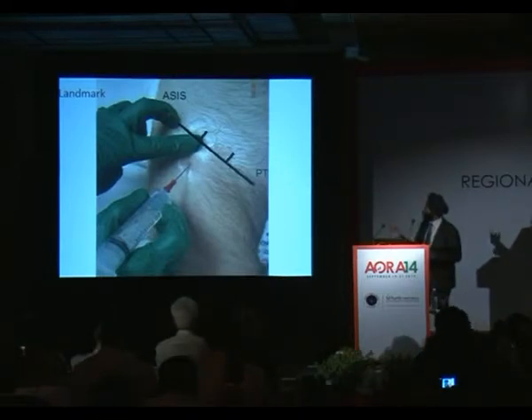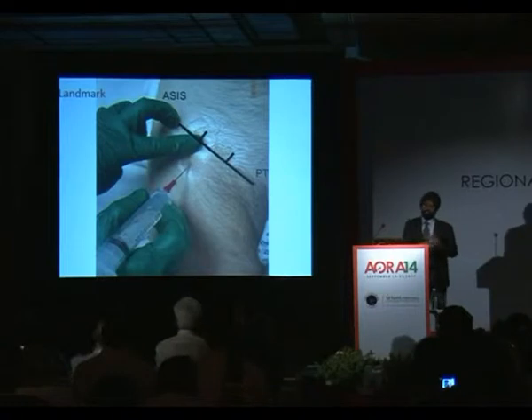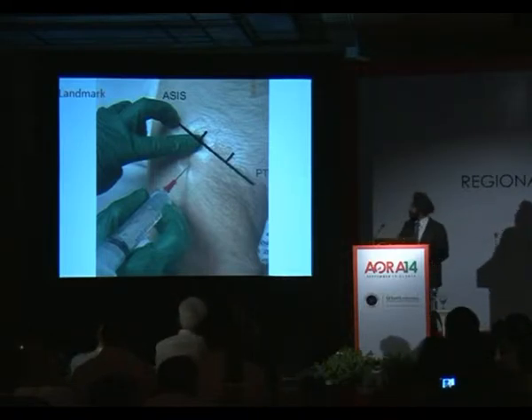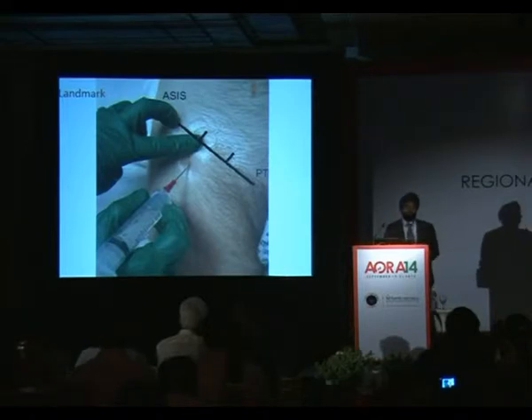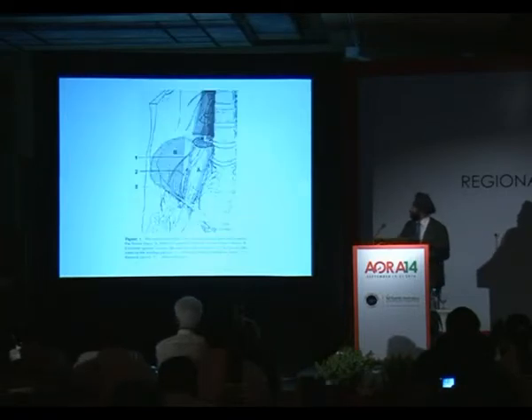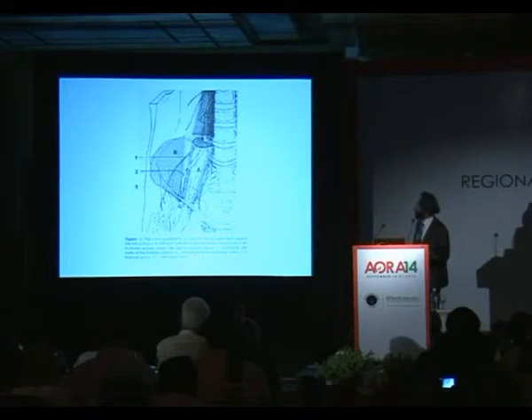If you're using a Tuohy needle, it's sometimes worth pressing your needle against the sterile cover which it has inside, which makes it a bit more blunt and the appreciation of the fascial planes improves. Always aspirate because it's a field block and you're giving a large volume of local anesthetic. So do always aspirate after every 5 mLs. And the local anesthetic spreads, even in about 20% of patients, up to the lumbar plexus.